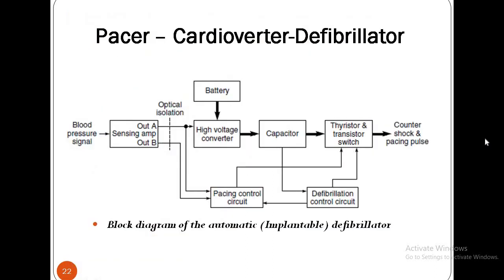The vast majority of cardiac arrest patients suffer from tachyarrhythmias which generally develop into ventricular fibrillation. However, a small percentage of cardiac arrest victims suffer from extreme bradyarrhythmias which require pacing. Therefore, most manual defibrillators currently in the market offer both demand and asynchronous external pacing facility.